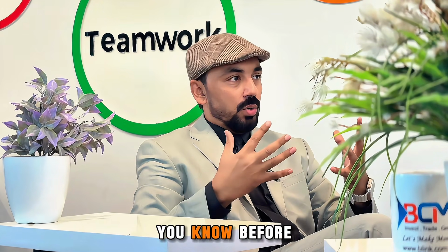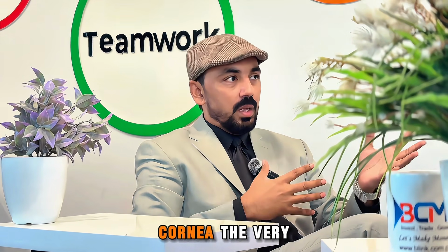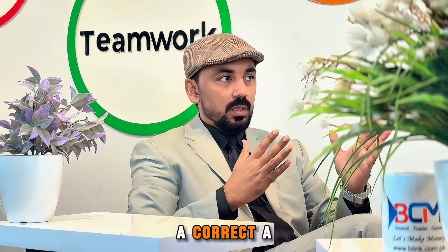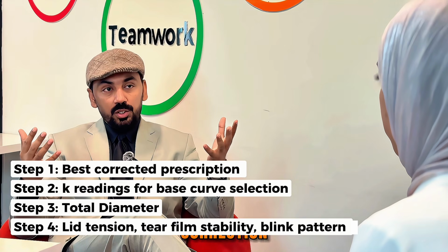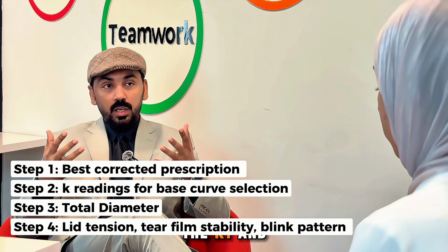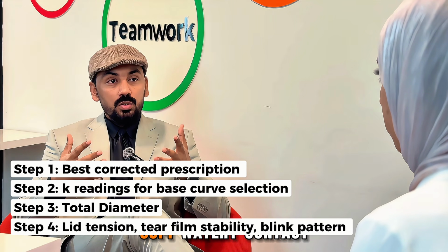Very nice question, Ms. Kashmala. We have to take care of so many things before inserting a soft toric contact lens on the patient's cornea. The very first thing is we have to perform a full-fledged refraction, a best corrected glasses prescription. So an accurate prescription is required: the best corrected spherical correction, the best corrected cylindrical correction, the best corrected axis, the refined axis, and the K readings, K1 and K2, for the base curve, and the diameter of the soft toric contact lens.